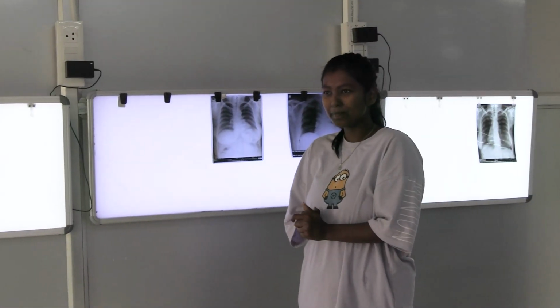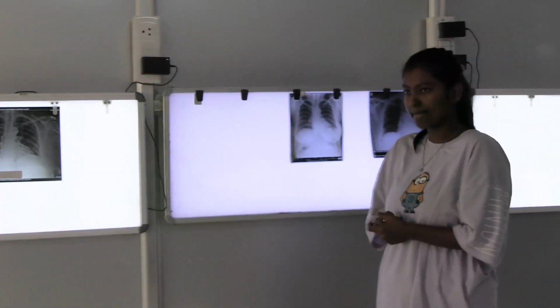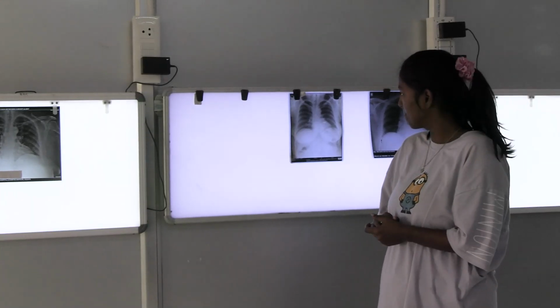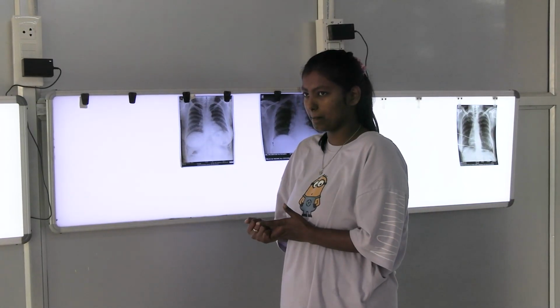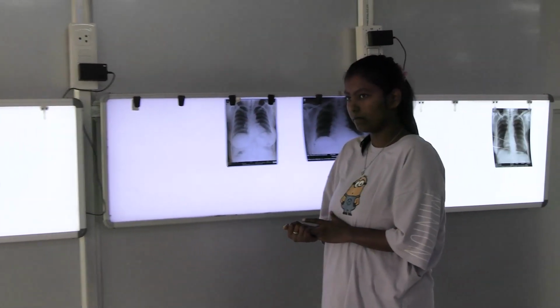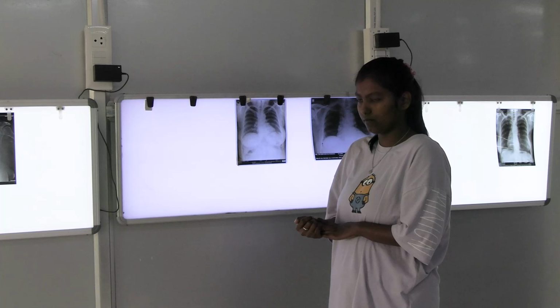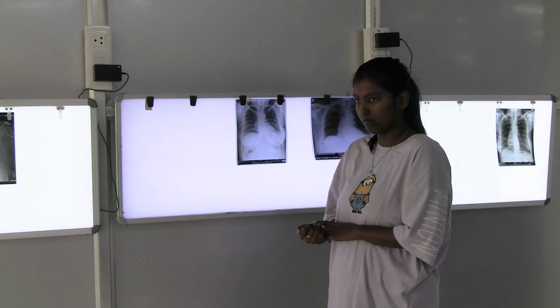So if it is completely penetrating the particular structure, and it is filled with air, which has maximum penetrability, it creates no shadows whatsoever; it runs through. That's why air gives black shadows. If it is penetrating with some resistance, penetrating partially, it creates what we call gray shadows.